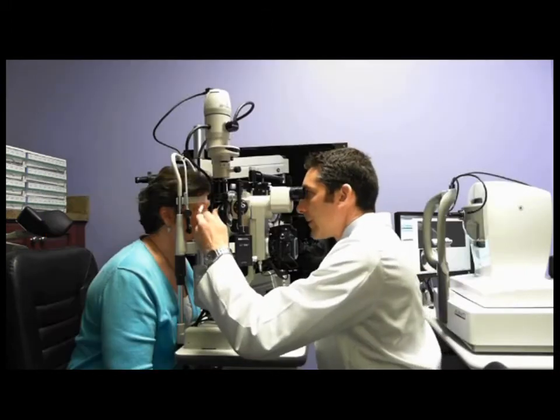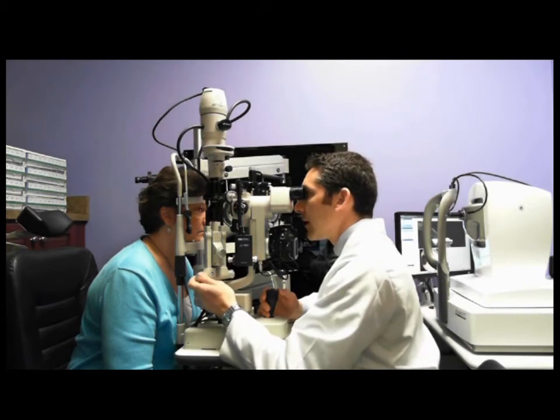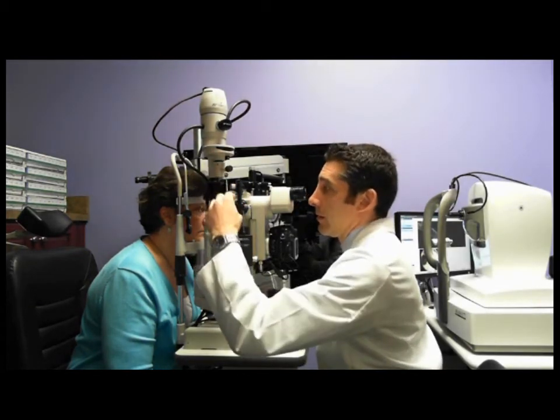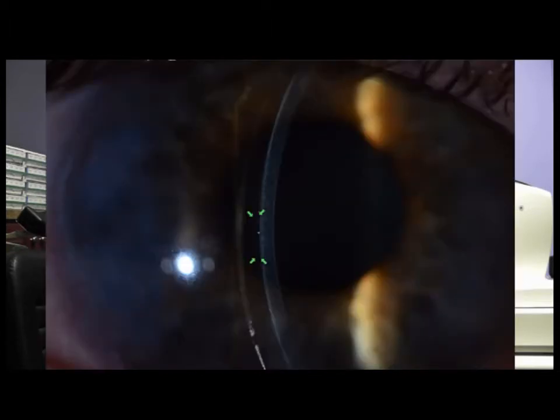Okay, so now let's get an idea of the amount of vault of this lens over the cornea. So I'm going to bring my slit beam to a 45 degree angle. I'm going to bring it down to an optic section, and I'm going to increase the mag quite significantly. And so what we notice here is there is quite a bit of post-lens tear reservoir that's available to us. This is not the greatest image that you'll see in this webinar. It kind of came out a little bit dark. Where the two arrows are the post-lens tear reservoir. And as we get into more optic sections, you'll be able to see this much better. And the lens and the whole system.